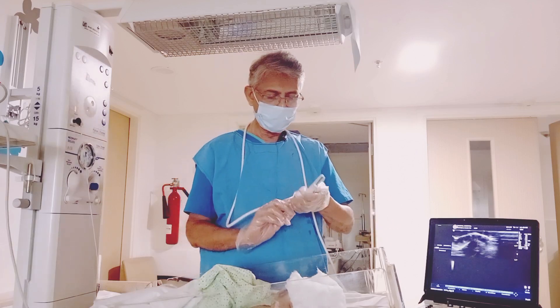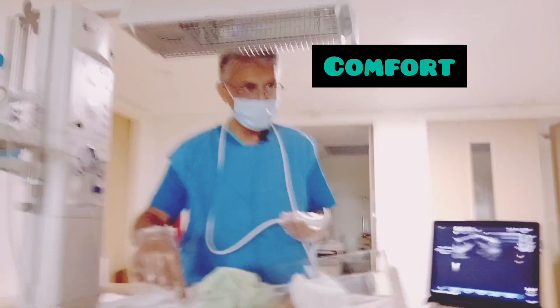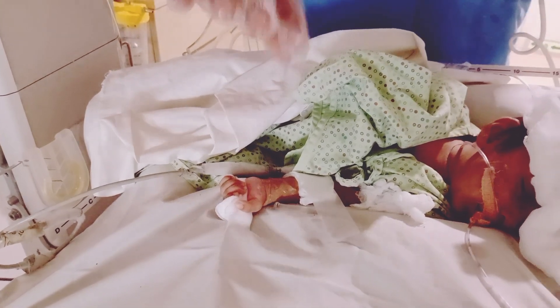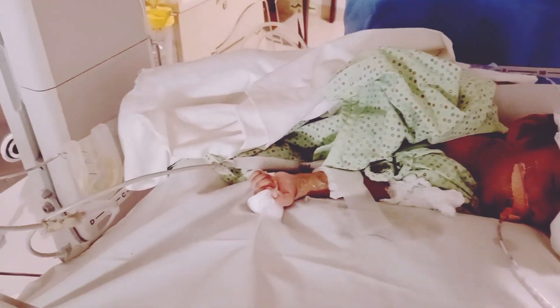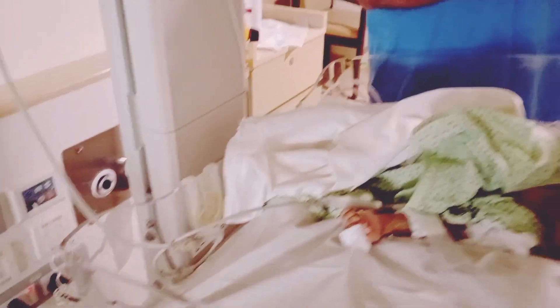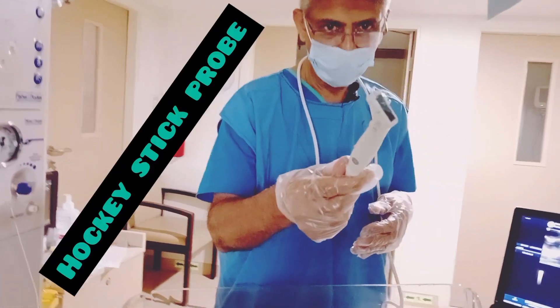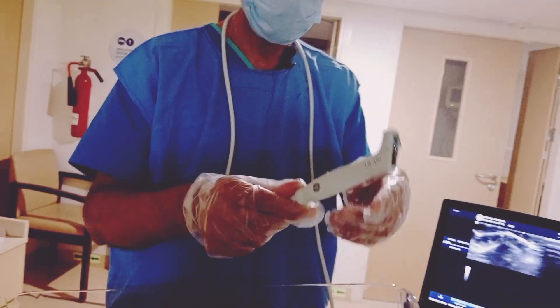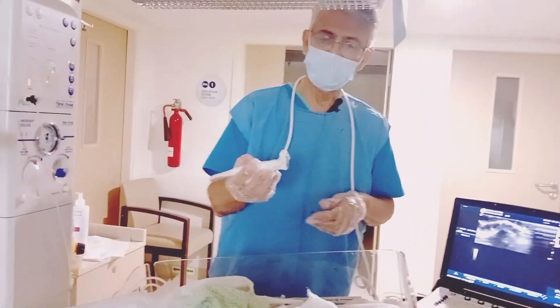We make sure the baby is very comfortable and the hand is restrained — you can see the hand is restrained and not moving. We take adequate gel, make sure the baby is fed and not in discomfort, and use the proper probe. This is the Hockey Stick probe, which is very good for vascular anatomy and Doppler ultrasound.